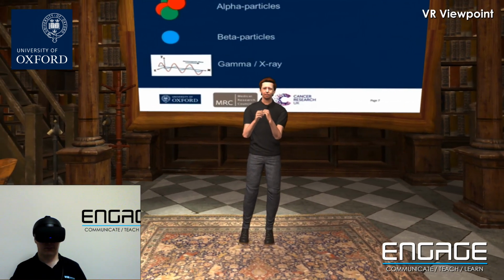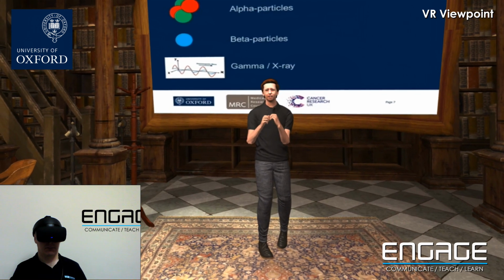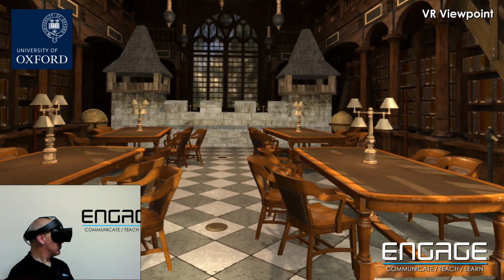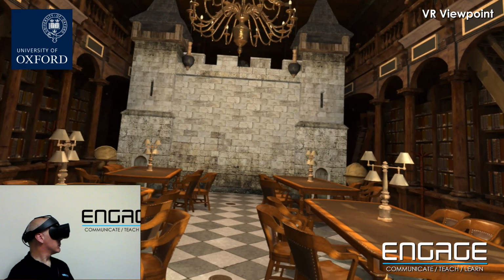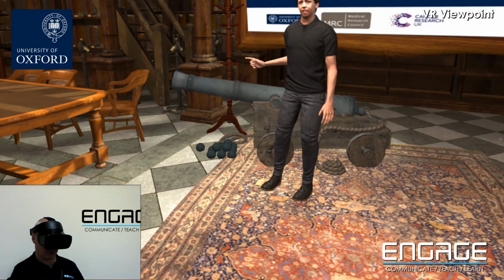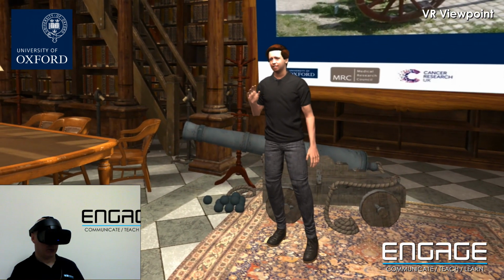I want to take a bundle of energy, I want to package it up in a form that will travel, and I want to be able to aim and deliver that radiation to a point in space, or to a point in a patient, and then have that energy delivered so that it can cause the damage that will kill the cancer. And so from that point of view, that cannon is shooting out a piece of radiation. That cannonball represents a packaged lump of energy.